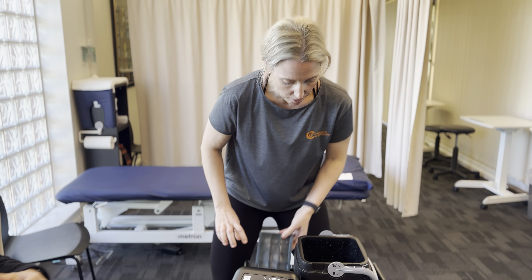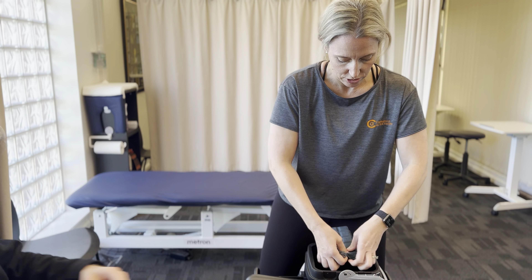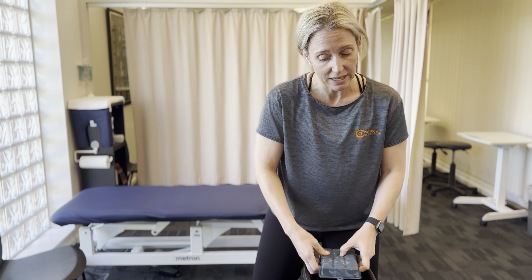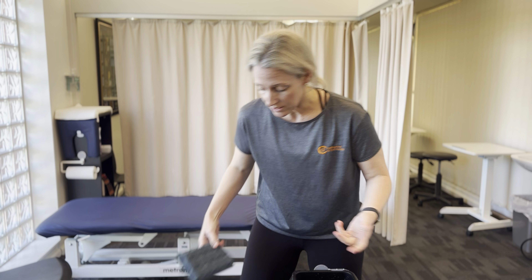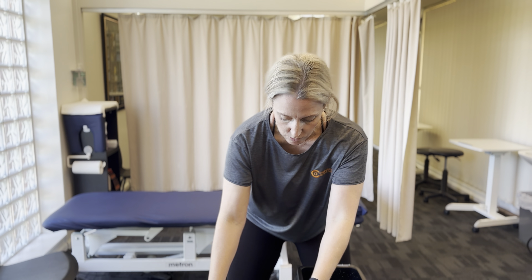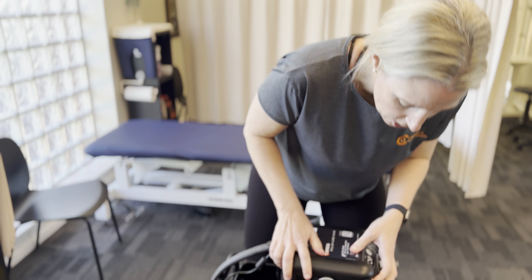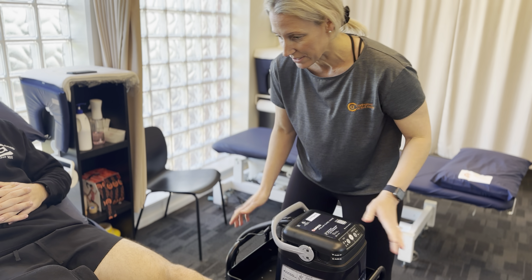I'm going to pop two in — it might not be quite full, but it will still work for the purpose of demonstrating how to use it. Now the Brigg Polar Ice is commonly used post-operatively after knee surgery, in particular ACLs and meniscectomies and sometimes total knee replacements as well. This pops back on after that, so make sure it fits in nicely and re-lock it, or it won't work when we press start.